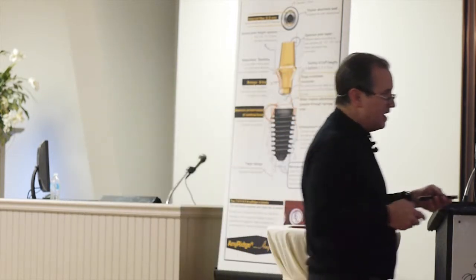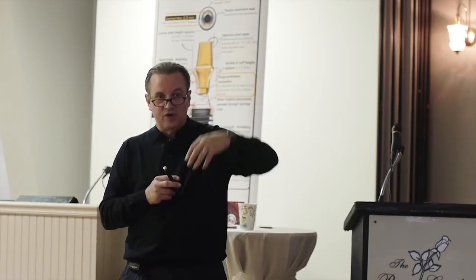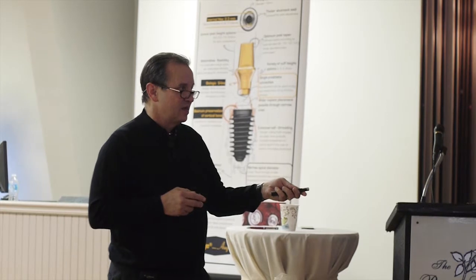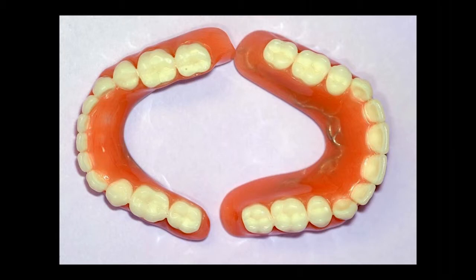Back in the day, I would use these mini implants so that we could get better initial stability with the overdentures, get rid of the palate. And nowadays, if I put AnyRidge implants in the mandible, I'll put the locators on the same day and put the housings in and have that thing snapping in and out, because it's just such good initial stability. Or if I'm chicken, I'll put in some real long healing collars and relieve that lower to where it's really sitting on those telescopes and getting real good initial stability instead of doing this. Because these things, sometimes they fail, they get sore, and you've got to take them out. Sometimes they hang around. In this case, she's still got most of them.